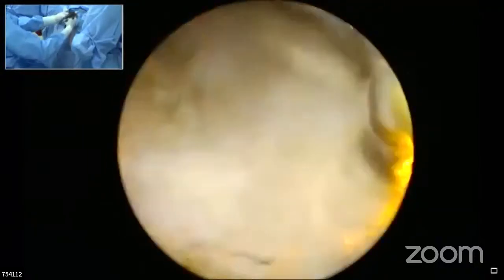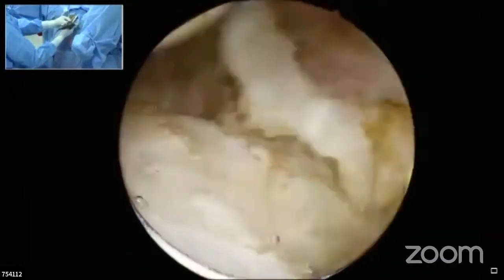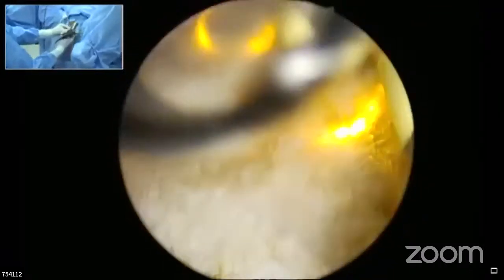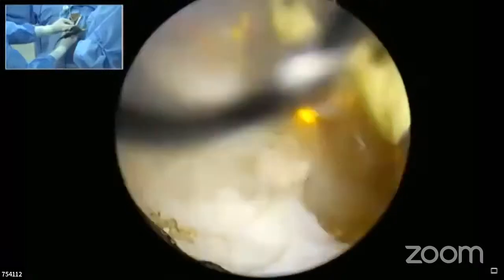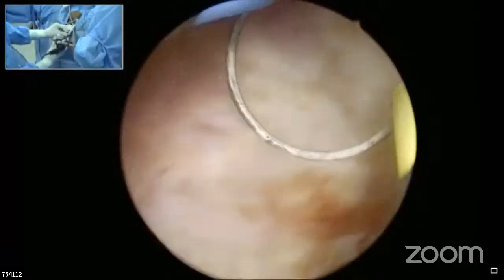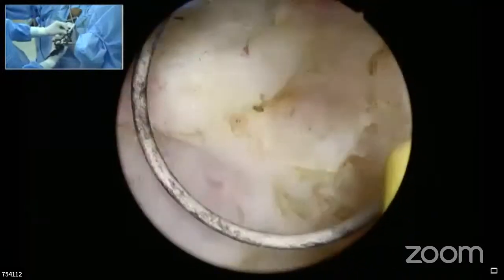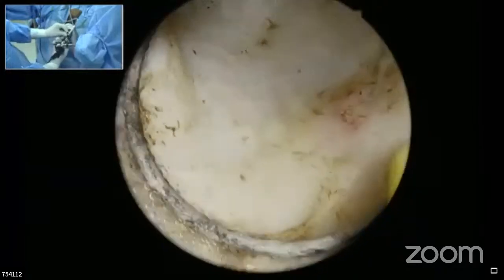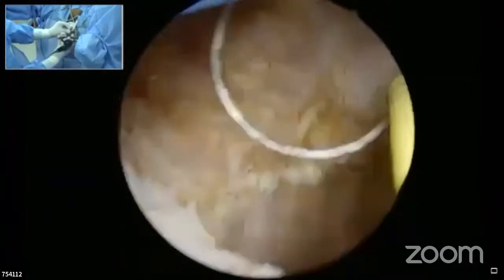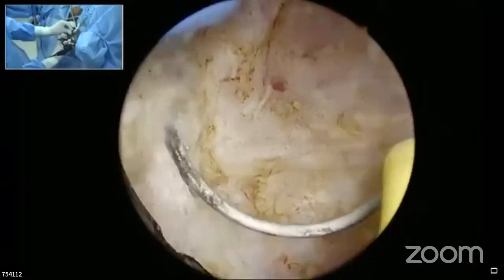Correct. That is the way. The most important thing in this is when you do your first cut at 11 o'clock or 1 o'clock, you must do it deep enough to get the vessel control, but not deep enough to open the capsule at that point of time. You must remain just short of the capsule with a good vascular control. If you achieve that, then this is the best way of doing lateral lobes.